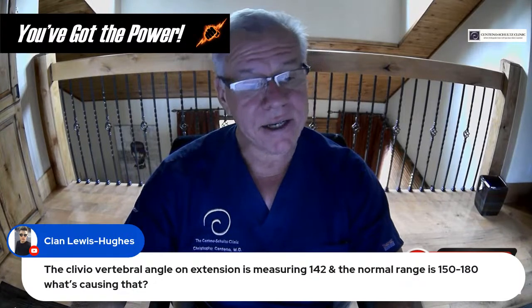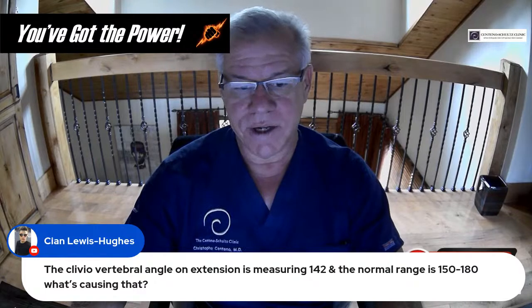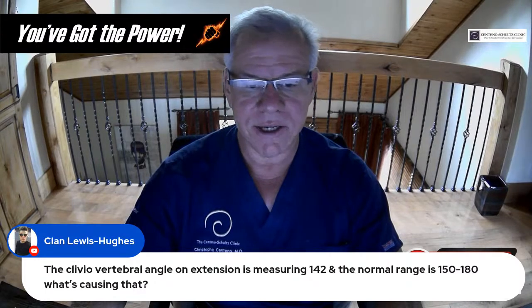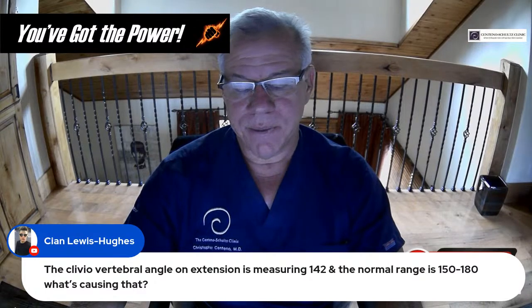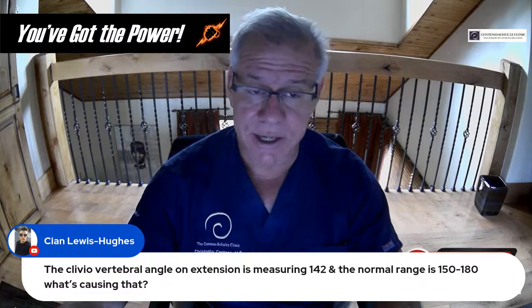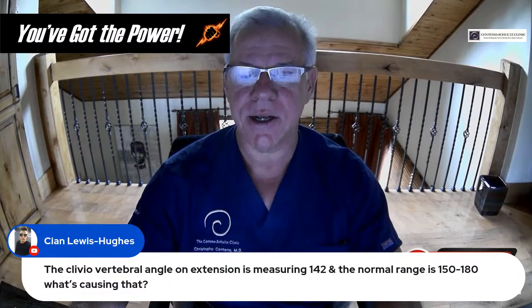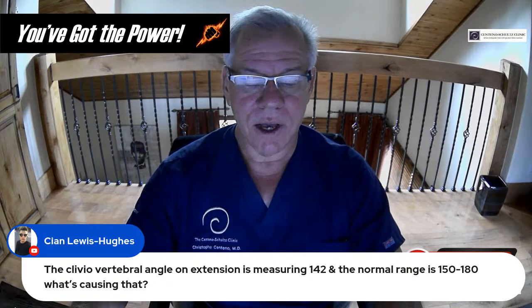The clivo-axial angle, or CXA, on extension measures 142, and the normal range is 150 to 180. What's causing that? I don't know that we have normal clivo-axial angles for flexion and extension, or that that's well studied in this kind of patient population.